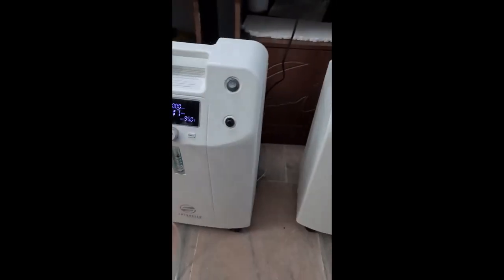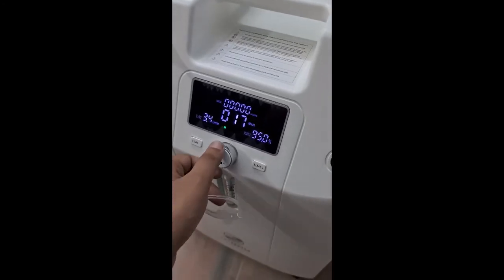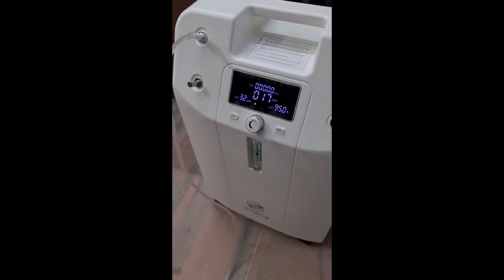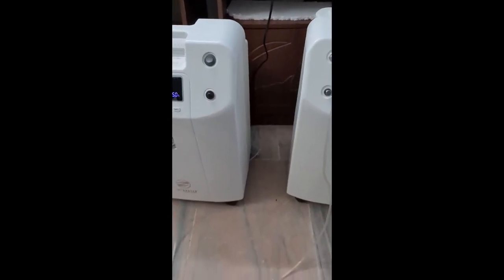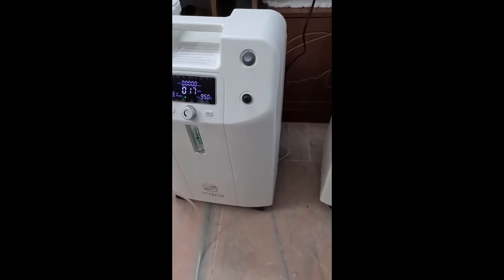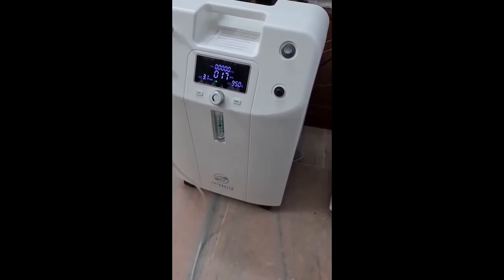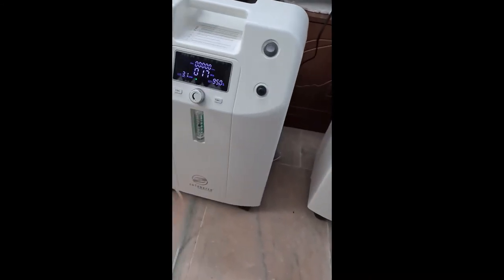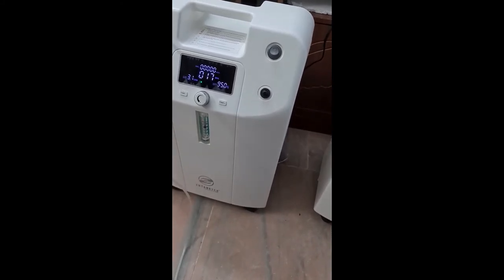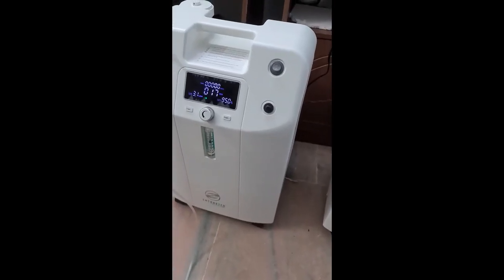Whenever you want to reduce the flow — say to 7 — reduce one machine to 3 and keep the other at 4, and you will get 7 LPM. This is very advantageous in the long run: once the patient's condition stabilizes, you can resell one equipment. Another main advantage is that both machines are fully portable and can be hooked up to an inverter. For hospital setups needing 10 LPM, standalone 10 LPM machines are also available on our website and in all centers.